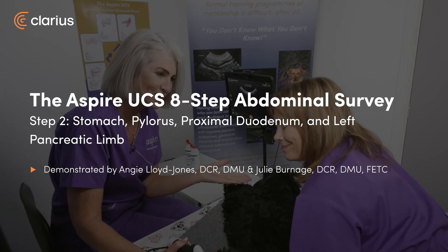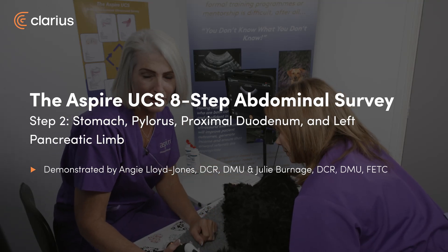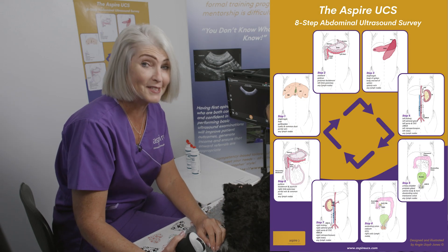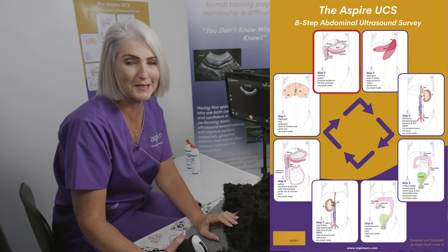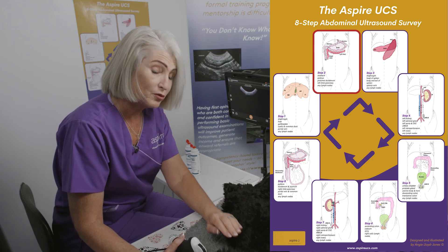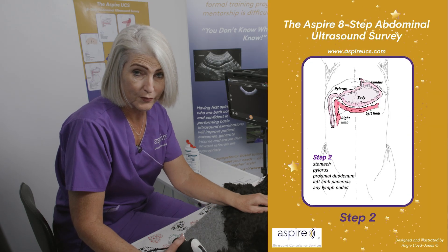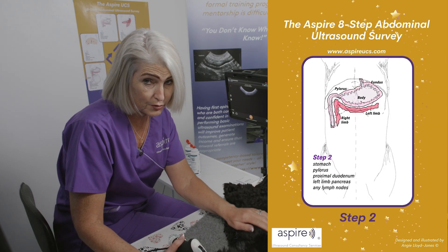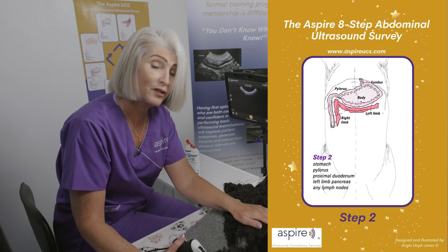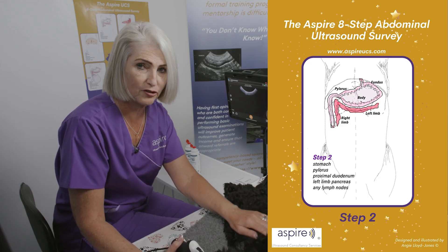Hi, I'm Angie, this is Julie, this is Oti and we're Aspire Ultrasound Consultancy Services. Today we're going to go through step two of our eight step abdominal survey. Step two includes the stomach, the duodenum — the proximal duodenum and the pylorus — and hopefully, if we can see it in Oti, we're going to tell you how you can locate the left limb of the pancreas.